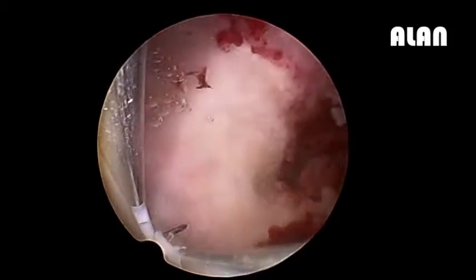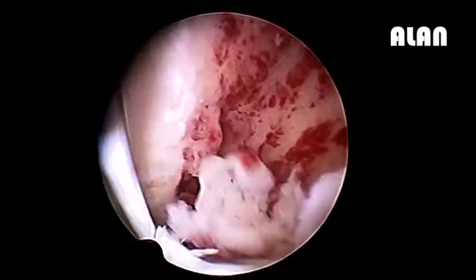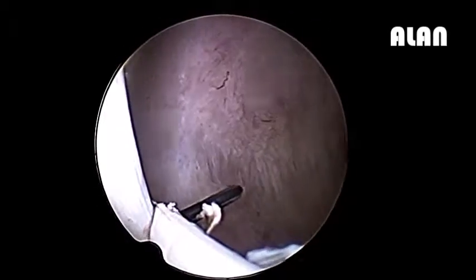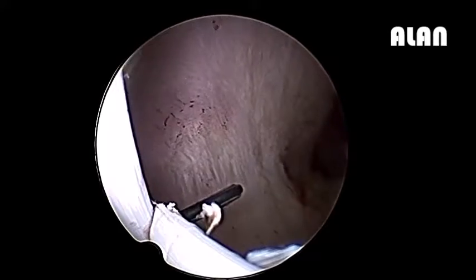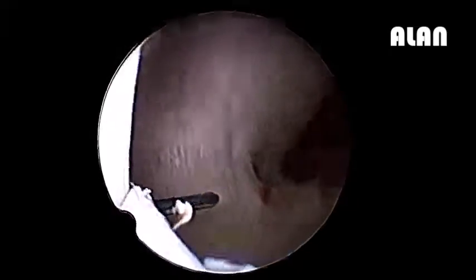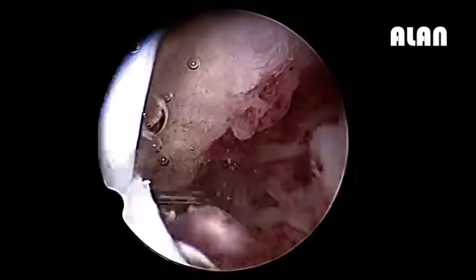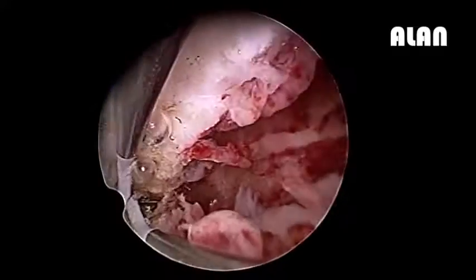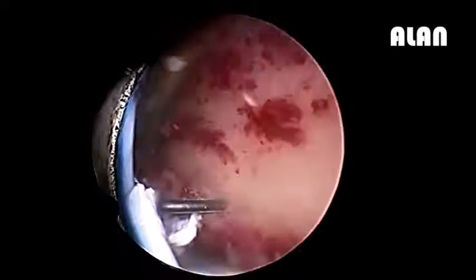Sir, this elevation in the center which still looks like a septum — how are you deciding that this much is the part that has to be left behind now? Well, we are unnecessarily cutting too much of myometrium if we continue. What will happen is that this patient will have epithelization of the incision we make in the myometrium. And then this patient will have a problem conceiving because if they go for IVF or ART there will be some fluid collection seen and they will not be happy with that. So, a lesser correction is good for her — a small subseptum generally does not cause any problem.